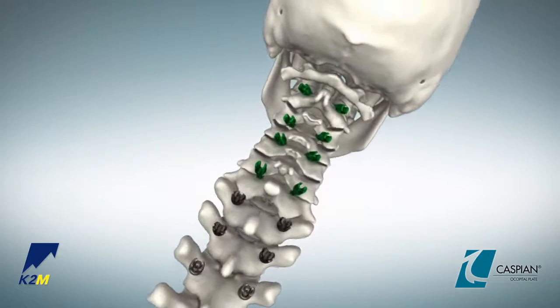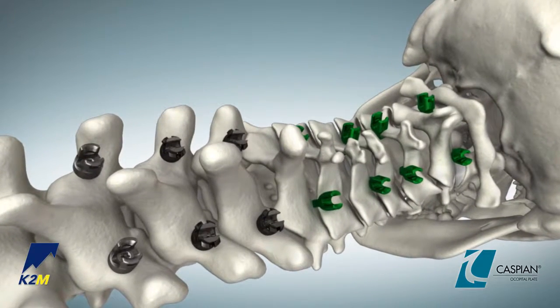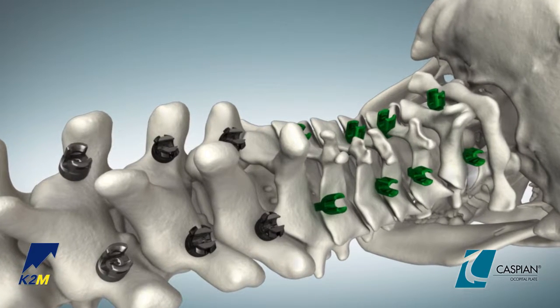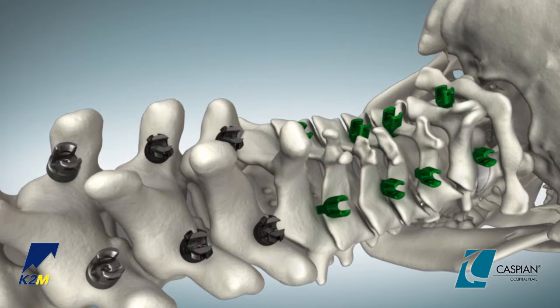Place hooks, Mesa Mini or Denali Mini screws and other supplemental fixation as appropriate. For instructions to insert, final tighten and remove hooks and screws, refer to the Mesa Mini or Denali Mini surgical technique animations.